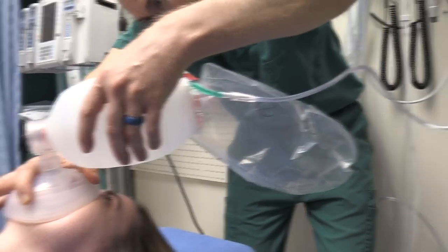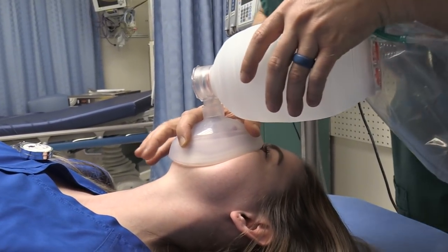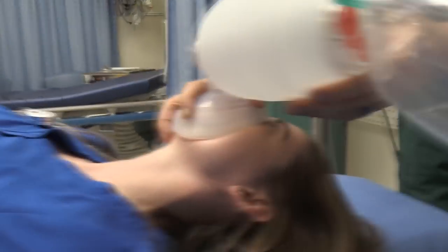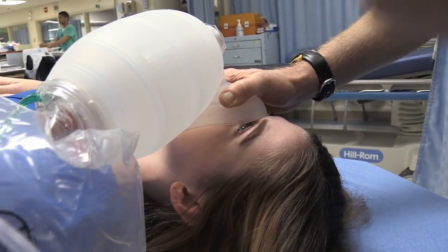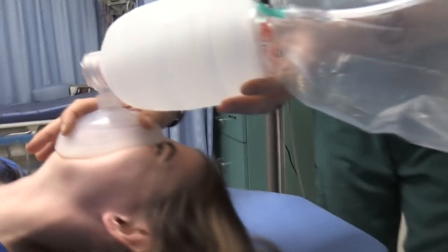Now, is that mask too big for her small face? It seems to fit right on. It's not in her eyes. We're not having any air leaking below the jaw. It gets up to the bridge of her nose, but you're not feeling any pressure in your eyes or anything like that. Do you feel any air leaking out? No. We can't hear you, Emily.